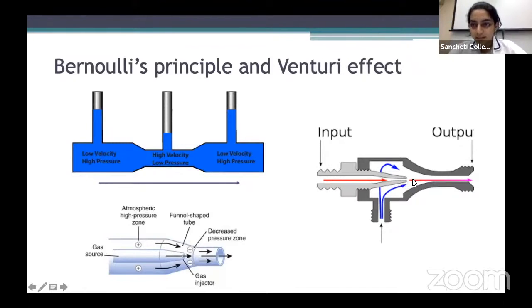When it moves at high velocity and comes out of this tube, it is surrounded by low pressure. So I have created a low pressure zone here. Now, if I give a small opening to this system, air from the atmosphere will move towards this low pressure zone, because flow occurs from high pressure to low pressure. So as the liquid or medication moves out, it is going to be driven by this air.